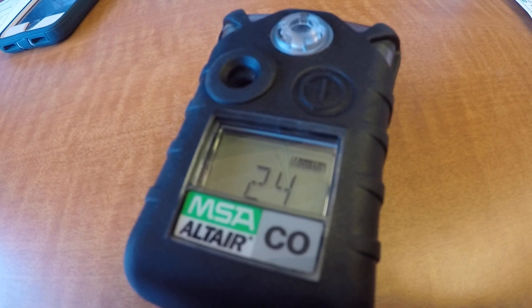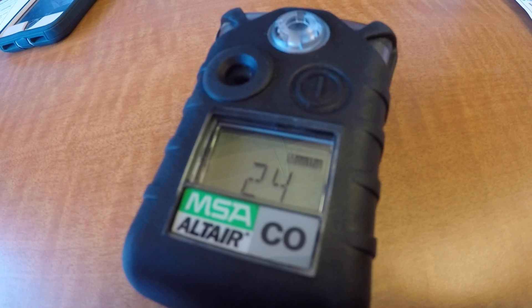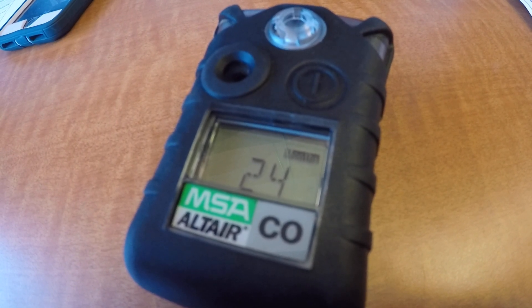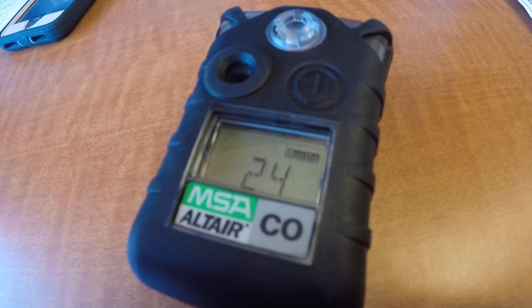Good day. Today we're here to talk about the MSA carbon monoxide detector, which is located on the first-end medical bags aboard Medic 19 and the lead engine.